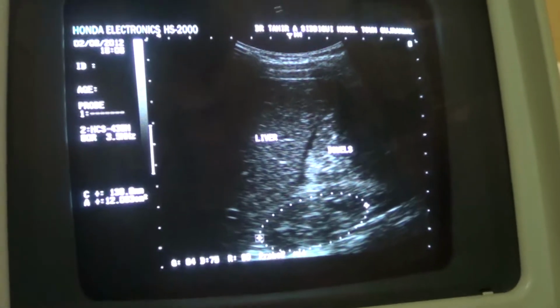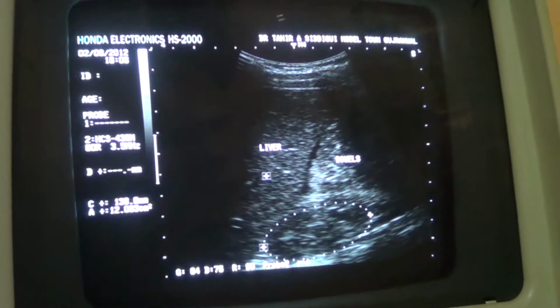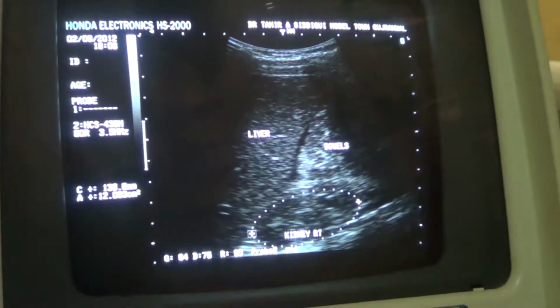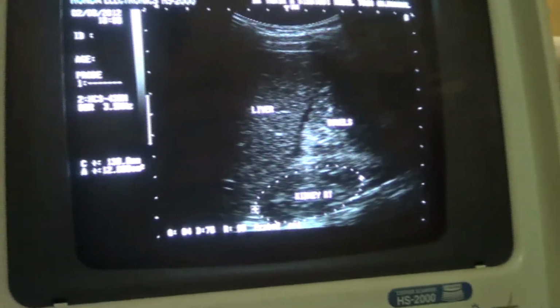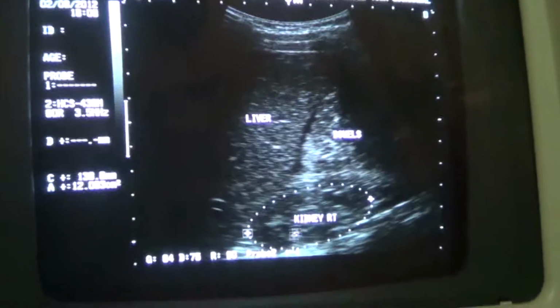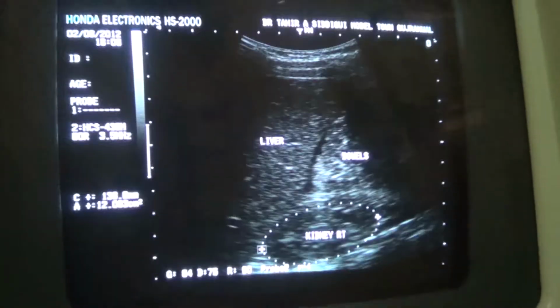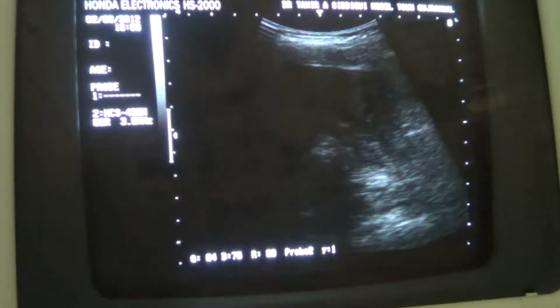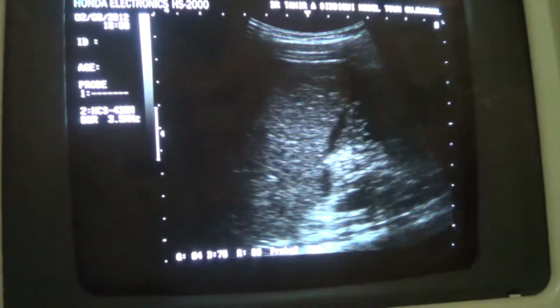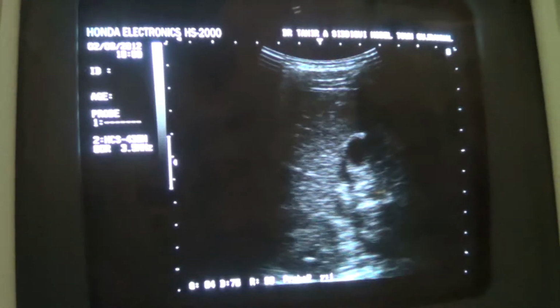These are all bowels. Now this thin black line you are seeing between the liver and the kidney, the right kidney in longitudinal section, partially viewed, not completely, this line is the fluid, what we call fluid in the hepatorenal angle. So there is fluid in the hepatorenal angle. So we have this finding with us. First finding, this is the fluid within the hepatorenal angle.